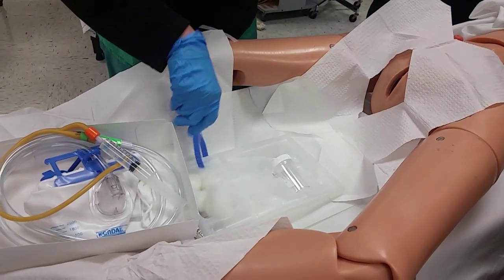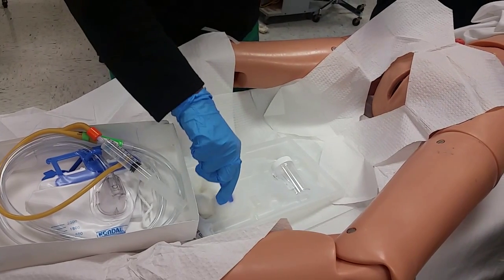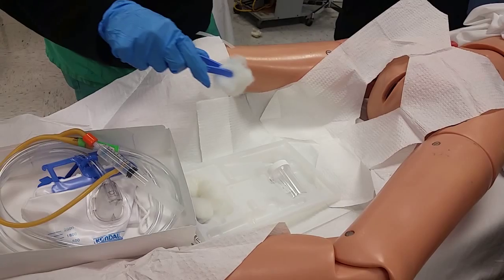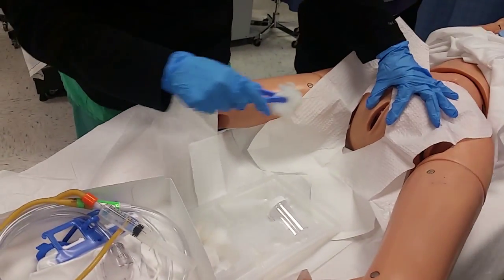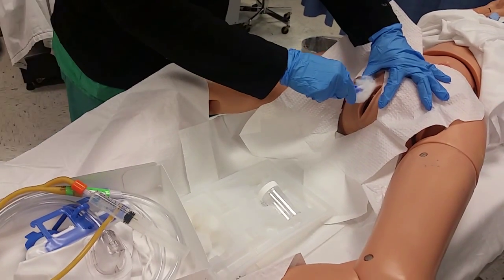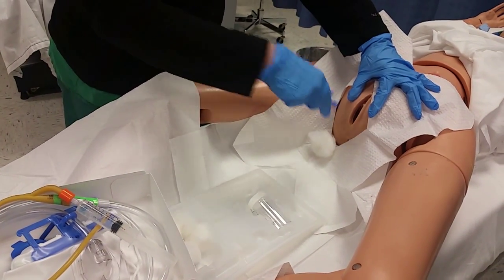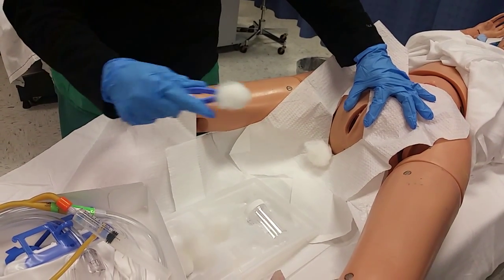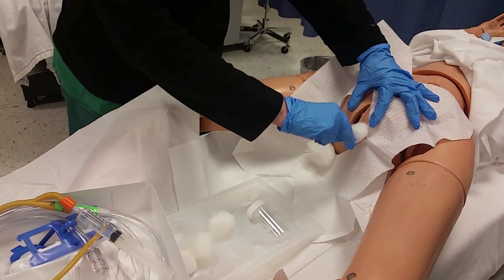So once this hand goes, it's no longer sterile. There's no coming back. On this one, you do not have to spread — that one is hard. So I'm just going to pretend so you all can see. Side, top to bottom, and drop it. Another one. When they're wet, they'll be easier to pick up as well. Side, drop.